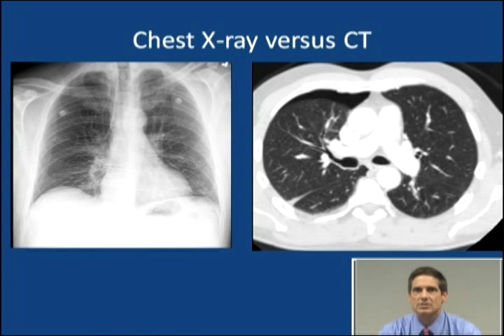Now, one of the advantages of using a CT scanner instead of a chest x-ray is that it does show you distinct different information, and typically much more information than the regular x-ray.